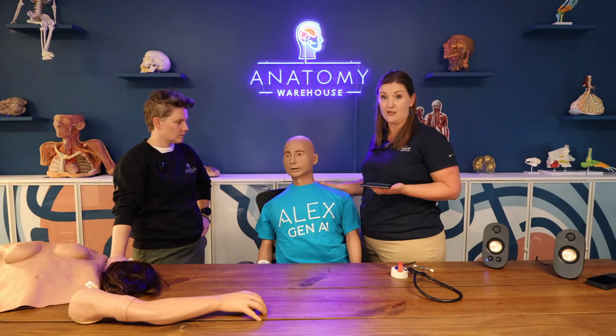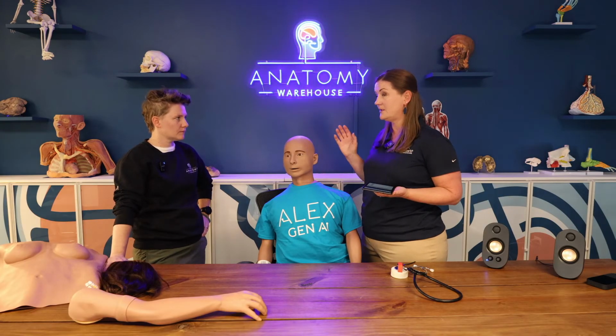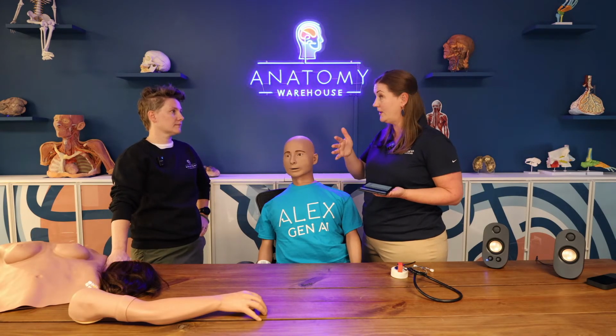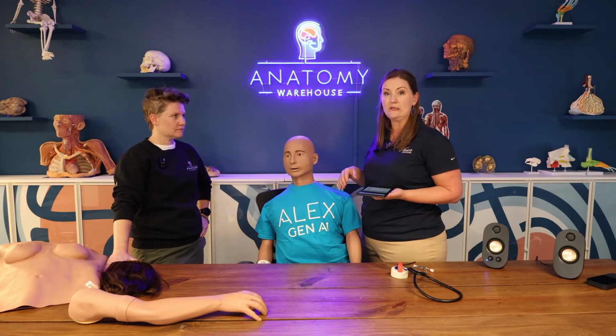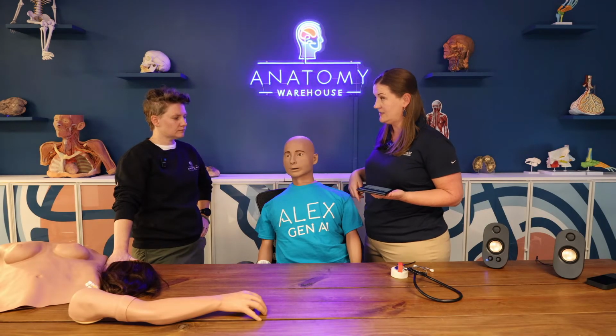Alex has a really nice long battery life, so with a full charge, he can go for about 8 hours, depending on how intensely they're running him. 6 to 8 is what we usually say that he will be okay to be wireless, tetherless. Also on his side is his power button.